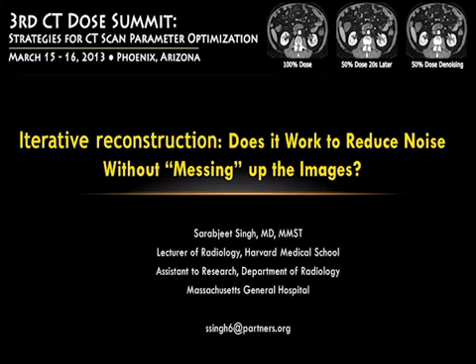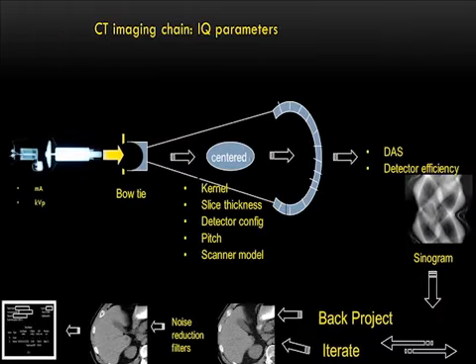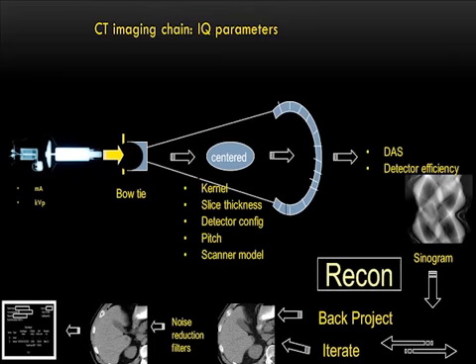All right. First of all, thank you everyone for coming to the CT Dose Summit, and I hope you learn new facts and strategies for CT scan parameter optimization. So these are my disclosures, and since I have roughly 25 minutes, I'll try to cover most of the iterative recon techniques. I'm sure all of you in this room are aware of the CT imaging chain, and what I will talk about in the next 25 minutes is how we take this sinogram data and reconstruct a 2D image out of it, historically and what we are doing presently.